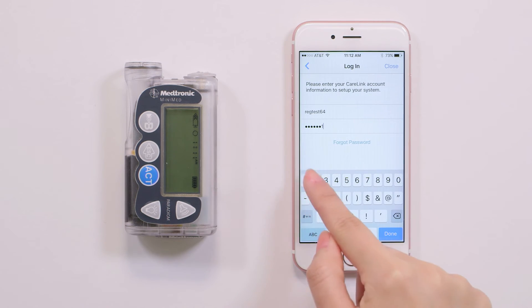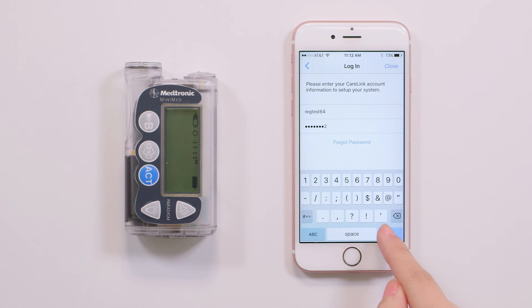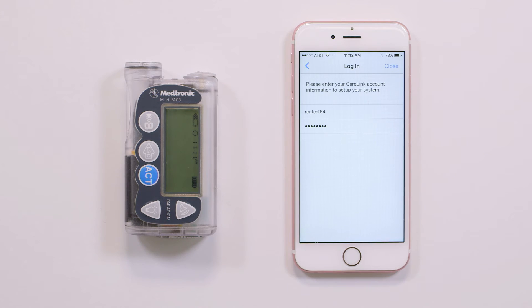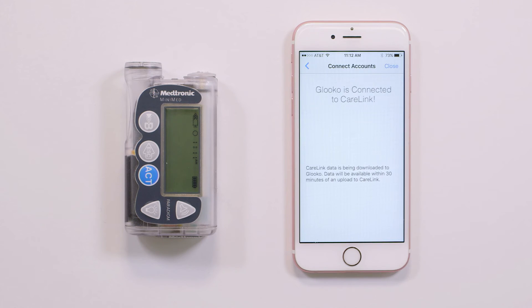Your CareLink personal account is now connected to Gluco, as shown by the screen checkmark. Tap Next.